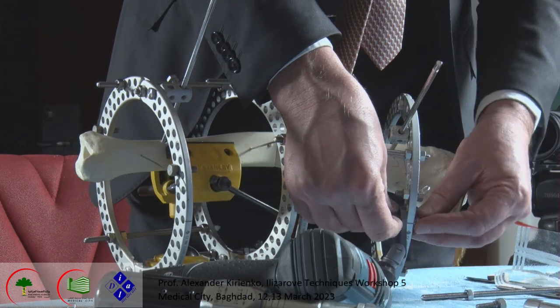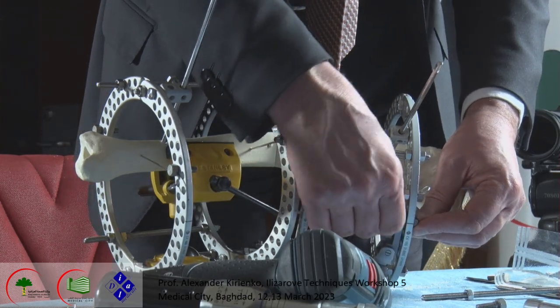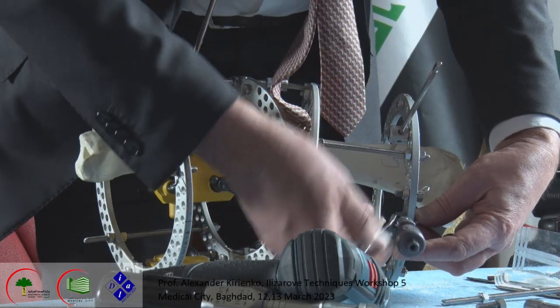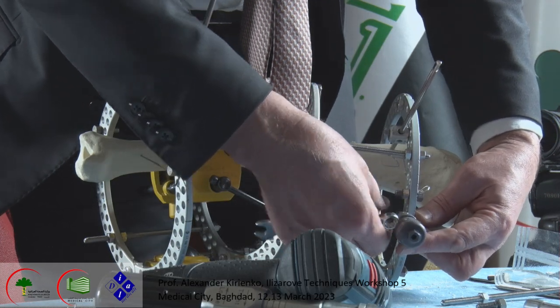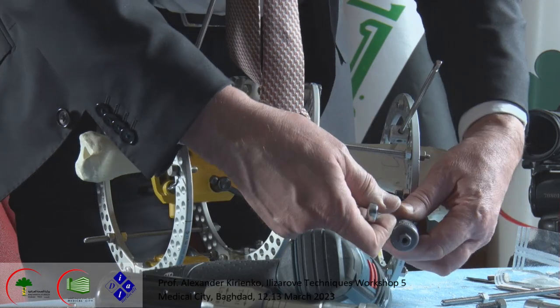There is a different system for creating the motor. Maybe if you had time, I show you. One of these is automatic, I may say, because it is much easier for the patient to use this one.